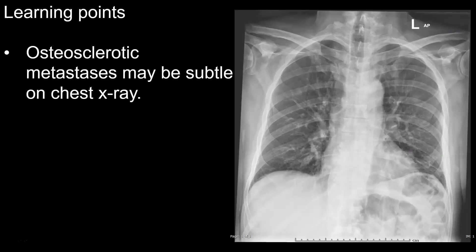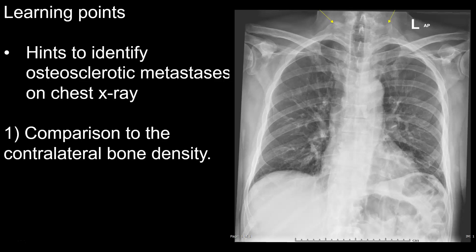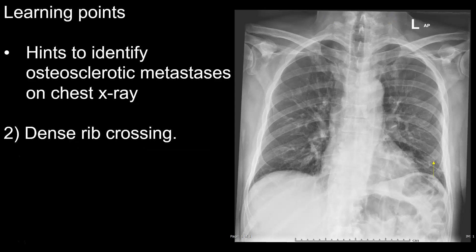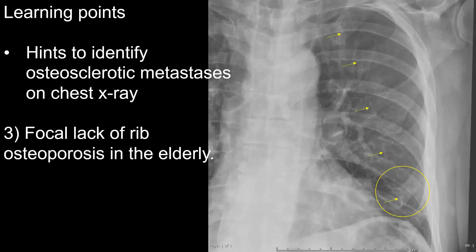We have learned that osteosclerotic metastasis may be subtle on chest X-ray, particularly if you don't have enough clinical data to drive you to search for them — as happened in the present case. The most important hints to make the diagnosis are: first, comparison to the contralateral bone density; second, the dense rib crossing sign; and third, the focal lack of rib osteoporosis in the elderly.